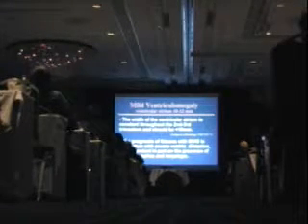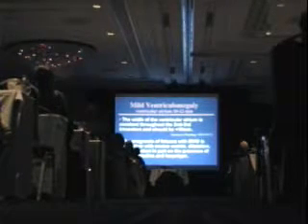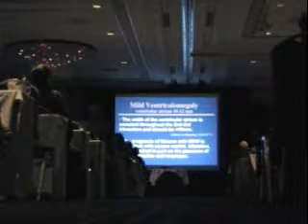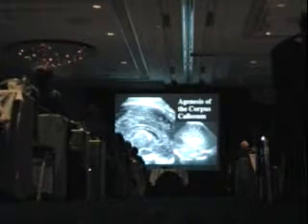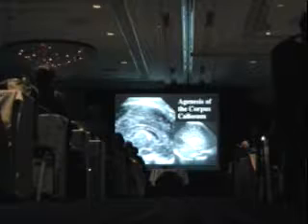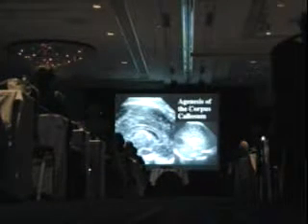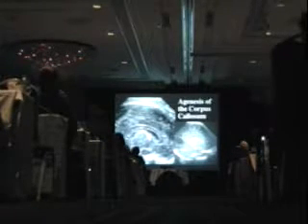So if the lateral ventricles are 10 to 12 millimeters, there have been some studies that have shown that the prognosis is better, much better, than if it's a severe ventriculomegaly. We did our own study, which I'll share with you in a moment. But when you have borderline ventricles, first of all, make sure that there's not agenesis of the corpus callosum, because that's a lot of times the explanation for borderline ventricles.